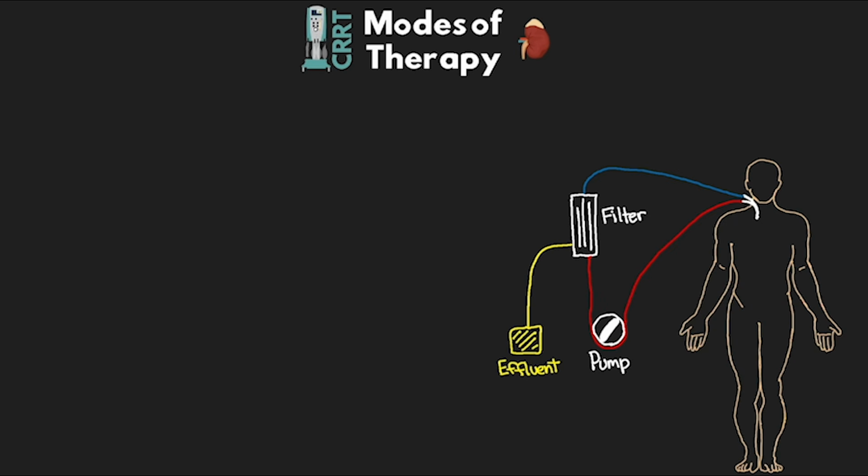And it's important to know that the therapy that we can offer people really consists of various applications of either hemofiltration, hemodialysis, or a combination of both, principles which were discussed in great detail in that last lesson. So as we talk about these different modes, I'm going to add them to this chart here so you can really see where they fall in this alignment of either hemofiltration or hemodialysis or some combination of both.